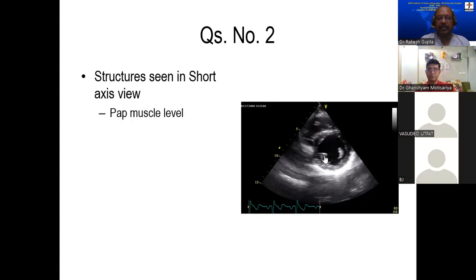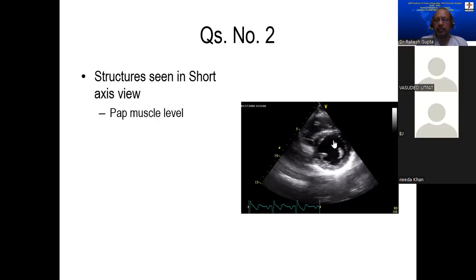Quick, we have 30 seconds to give an answer. Vasudev, what is this? Are you able to hear me, Vasudev? Dr. Vasudev.